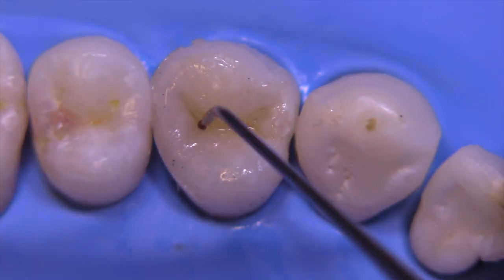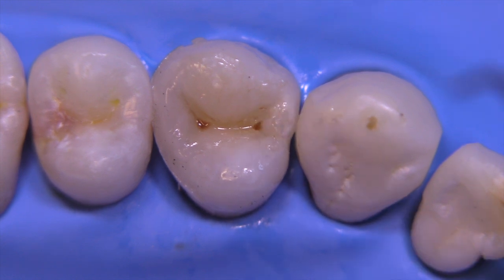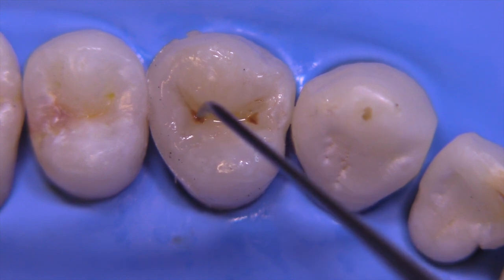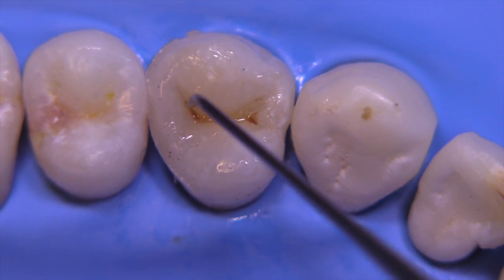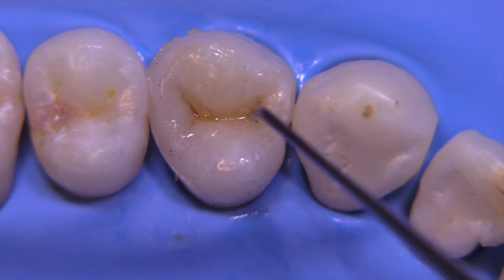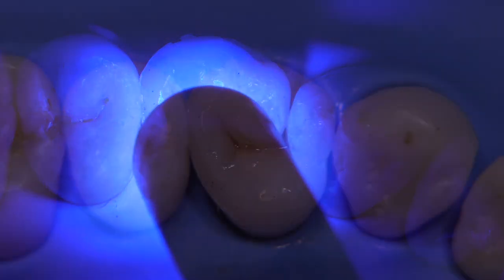Then we're going to mix up some brown tint for a deeper-looking stain. I don't like placing a lot of stains on the surface of the composite because they wear off too easily, or you polish them away when adjusting occlusion or doing a final polish. So I like to build them intrinsically, much in the same way that a ceramist would build a crown or an onlay — placing these stains inside the restoration and making them a lot more subtle.